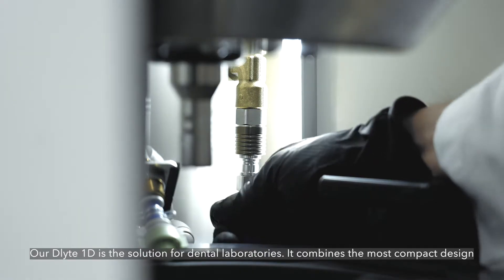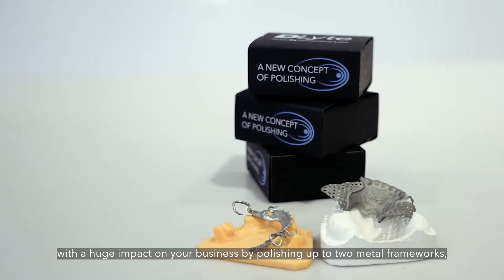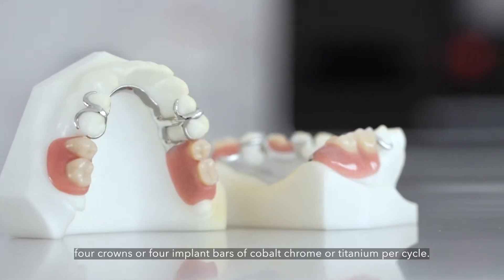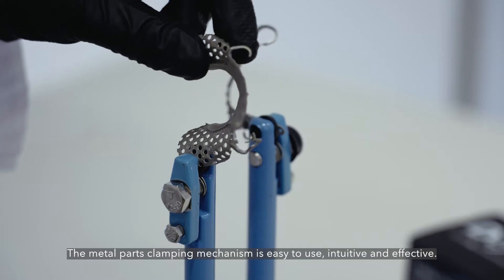Our D-Lite 1D is the solution for dental laboratories. It combines the most compact design with a huge impact on your business by polishing up to two metal frameworks, four crowns or four implant bars of cobalt chrome or titanium per cycle.